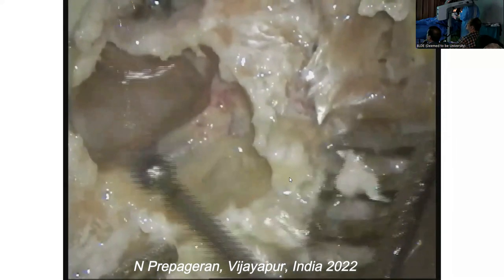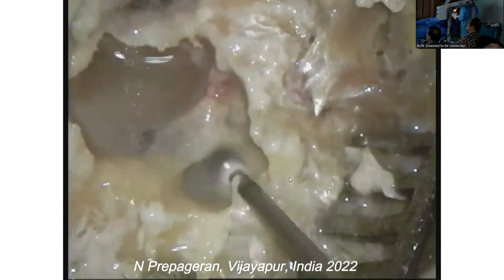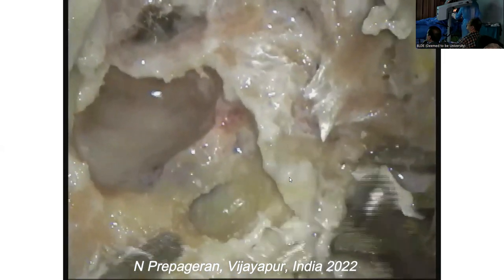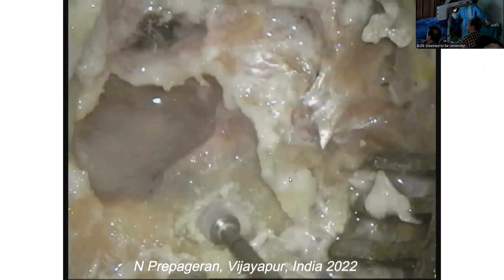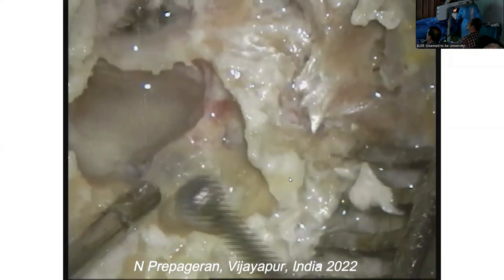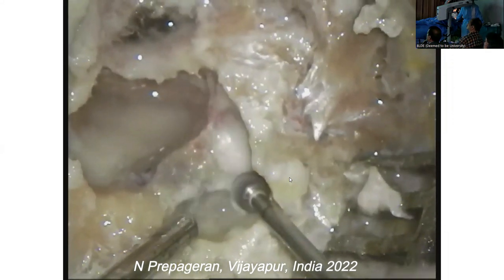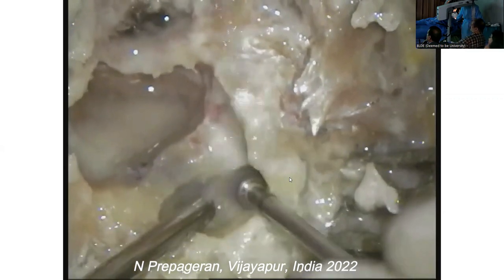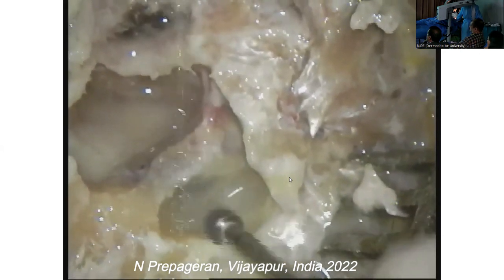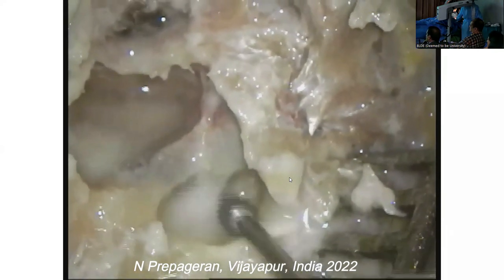Go slow because I'm using a cutting drill. And then you want to do retro sigmoid. Can you see how much you need to drill? There. I can already see the sigmoid sinus there quite nicely. And that's the dura of the retro sigmoid. So usually I give this exposure to my neurosurgeon. I give retro sigmoid and presigmoid so that they don't have to compress the cerebellum.